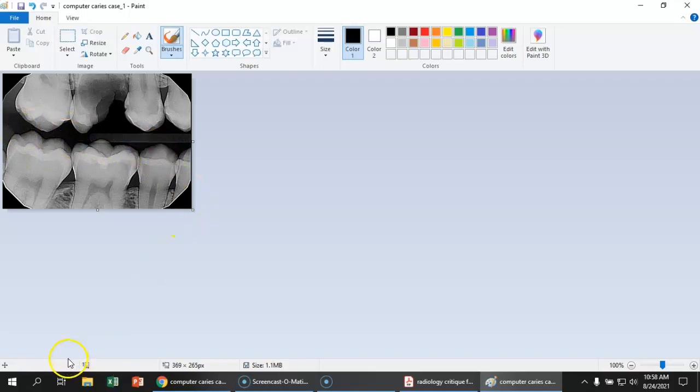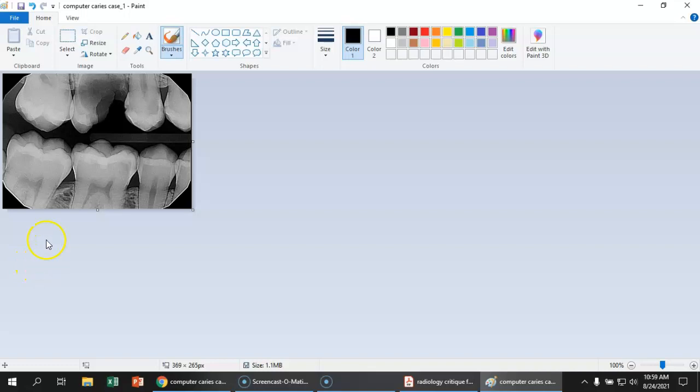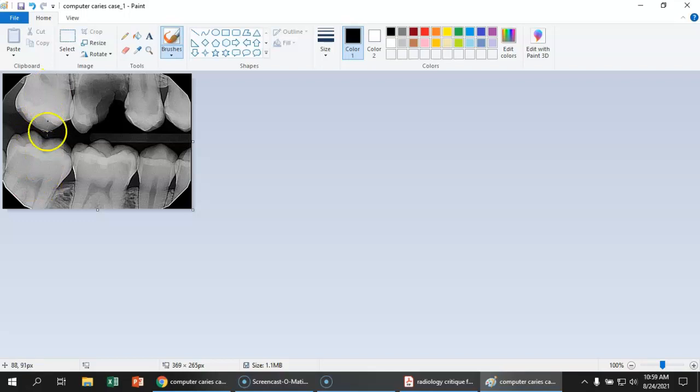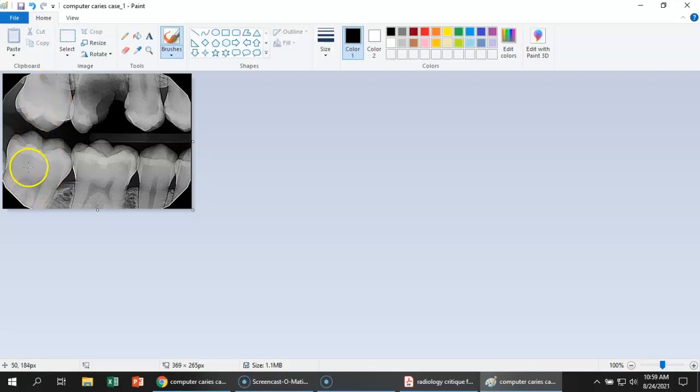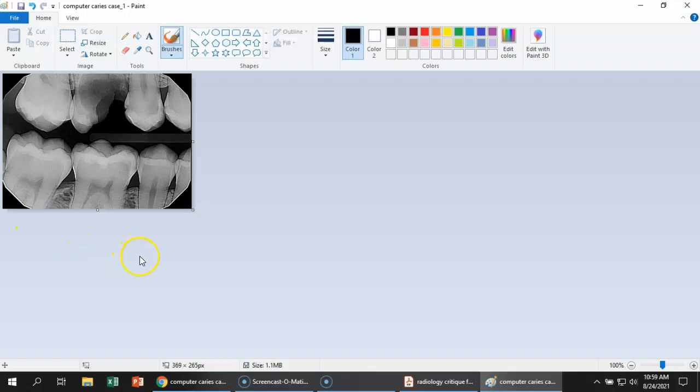Now is it a molar, or is it a premolar? Well, we know that the criteria for the molar shot is that your second molar should be centered in the film. These are the second molars. They should be centered in the film, and you should see the third molar space. The criteria for a premolar bite wing is that you should see the distal, or the back portion, of the canines.